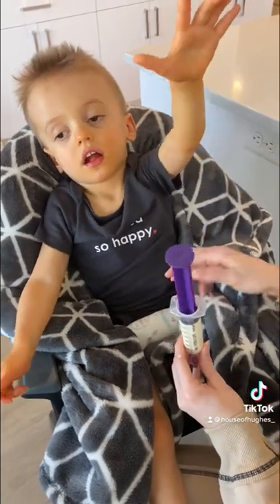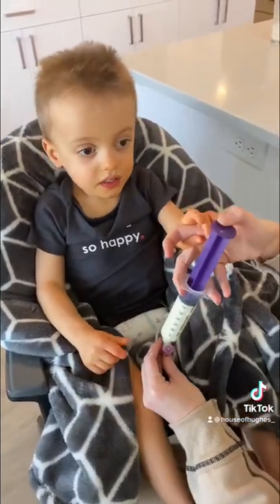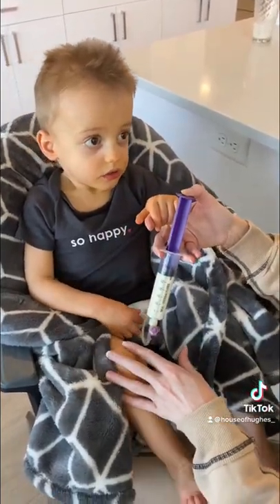Good job, you're going to help me. Then I will slowly push in the feed and it will take two to three minutes.